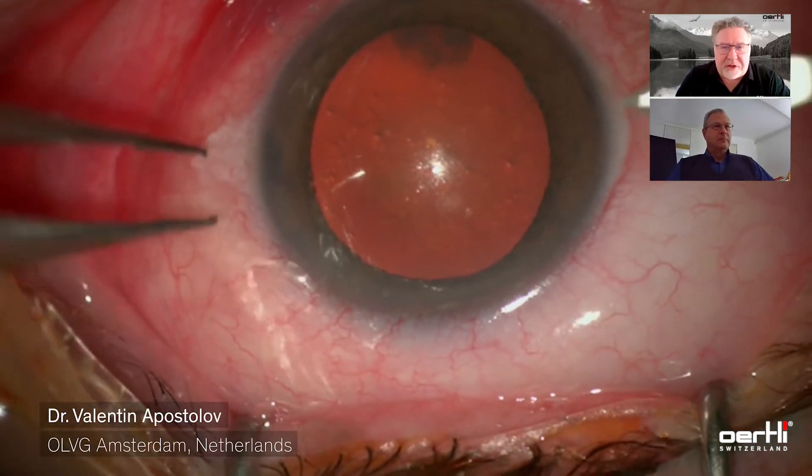Welcome to our short interview with Valentin Apostolov, a senior surgeon at the OVLG in Amsterdam. They perform approximately 3,000 cataracts per year, and Valentin handles many difficult cases involving small eyes, very hard nuclei, and more. Besides cataracts, he is also a specialist in glaucoma surgery. The focus of this interview is how to work with our machine while performing cataracts. So Valentin, what surgery are we going to see?